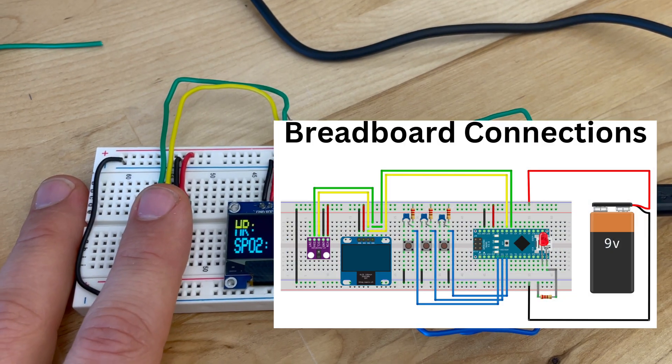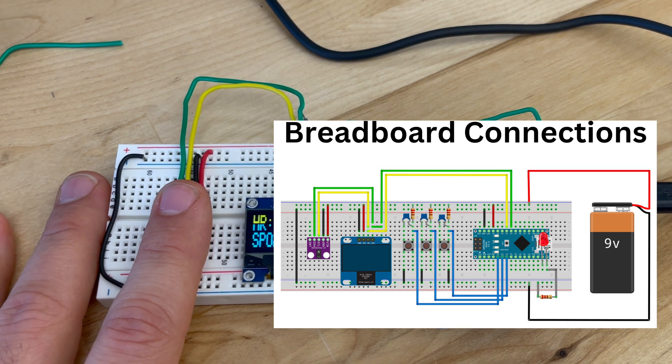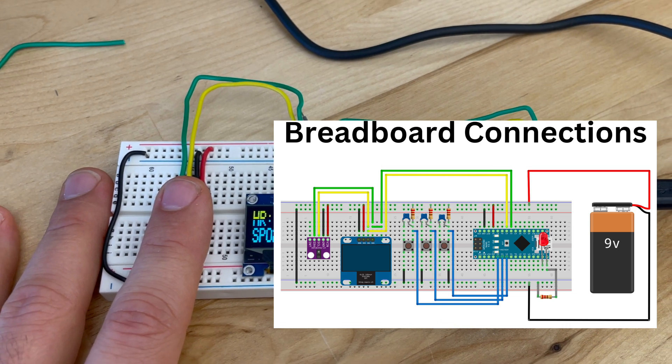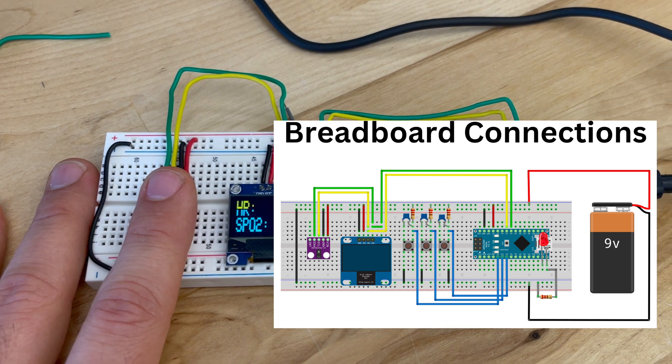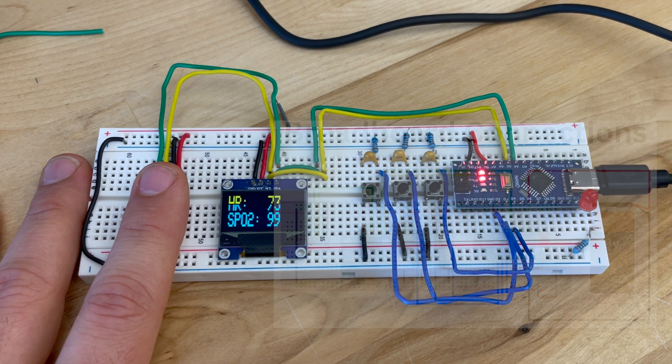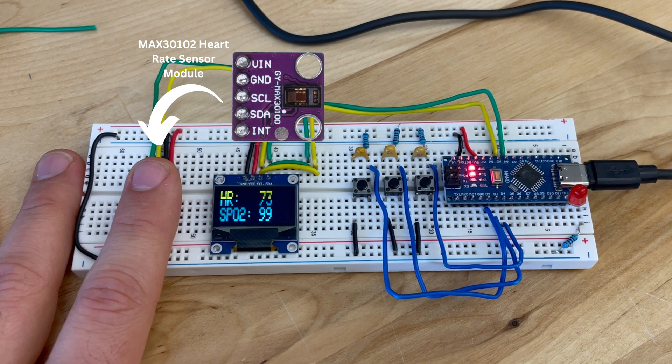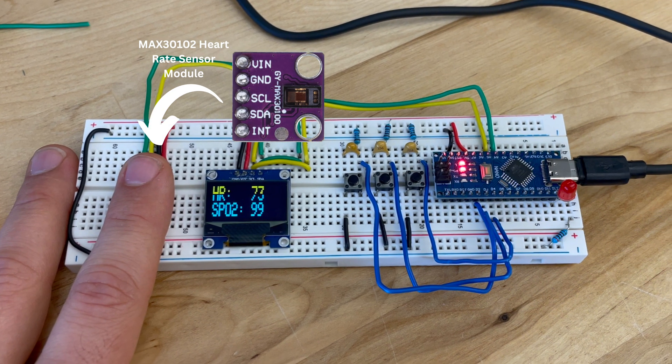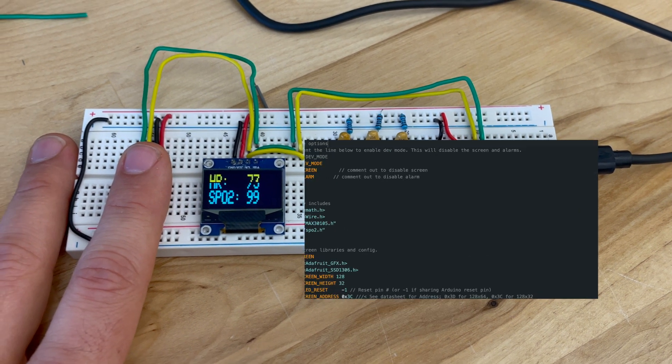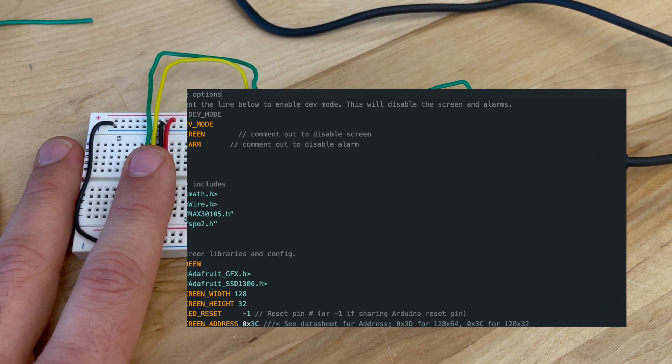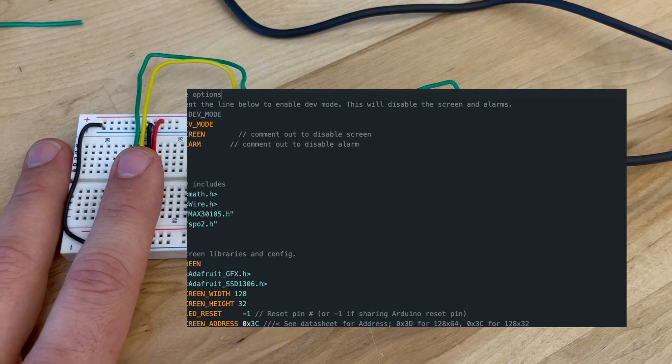Here are the breadboard connections for the circuit. And here's the MAX 30102 heart rate sensor module that's being used. You can find the code for this project on the htm-workshop.com website.